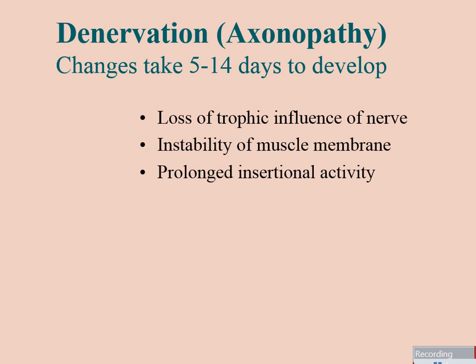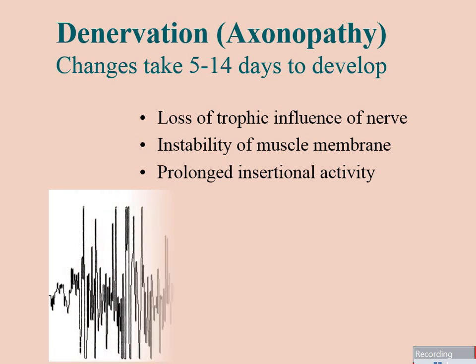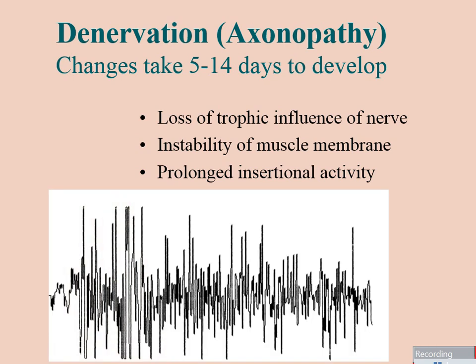And so what we're going to see when we have denervation, the first thing we see is that because those fibers are kind of irritable, the irritation that needle creates is more dramatic, and we get a prolonged insertional activity. So it doesn't stop as soon as I stop. It keeps going. Okay?